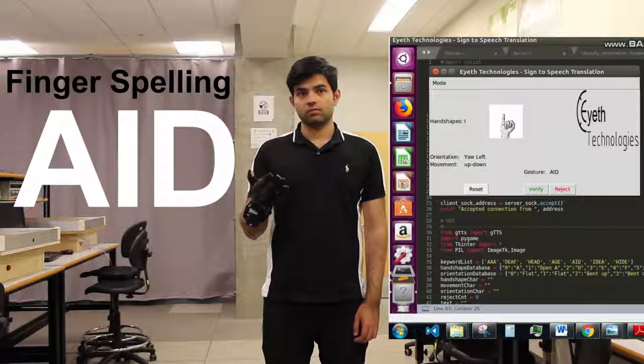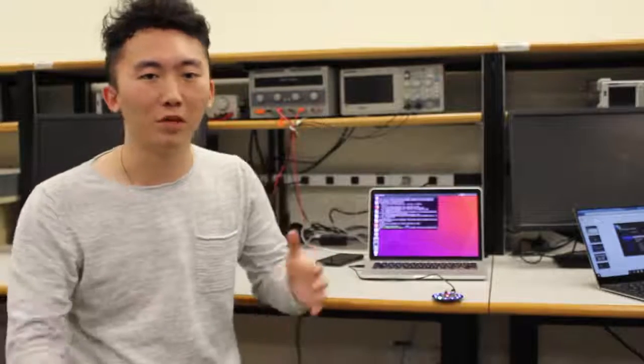For our second part of the prototype, we are focusing on deaf individuals being able to understand people speaking to them. Now, to tackle this, we present a voice localization unit, which translates speech into text as well as pinpoint audio sources. As mentioned before, we have our voice localization unit here.